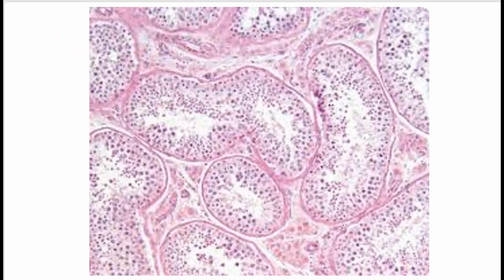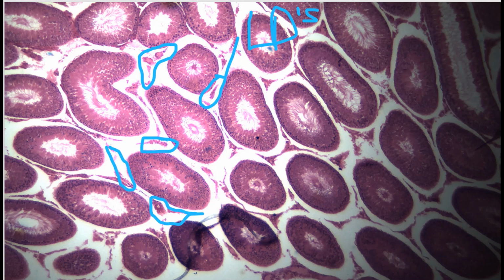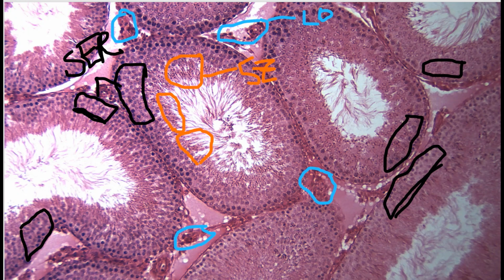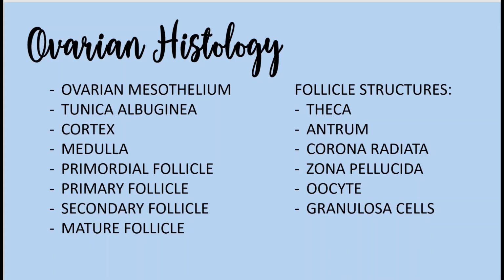So if you would like to look at this image or this one, or if you need to go back to any of these, just feel free to pause the video and take another look, because we're moving on to the big gun, ovarian histology.